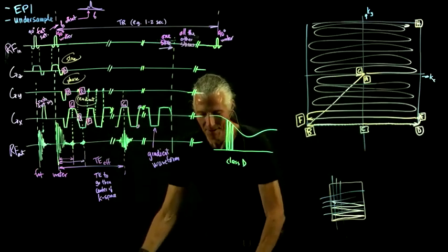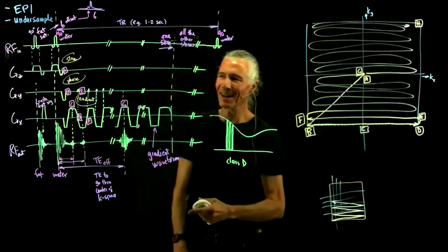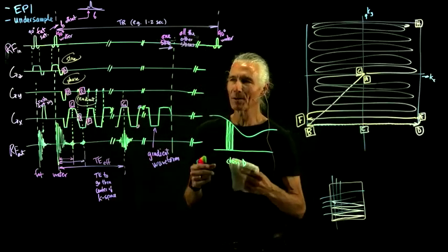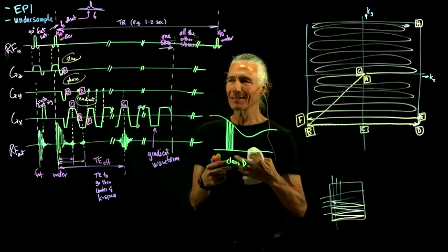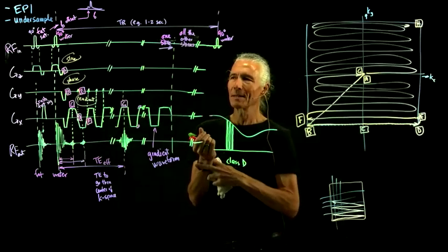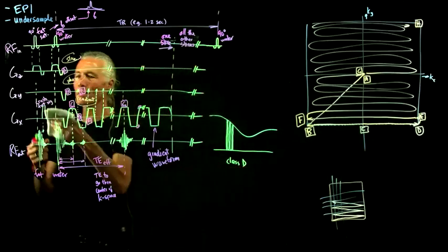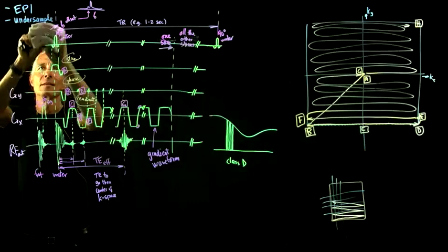Okay. So we haven't talked about speeding this up even further, and so that's for Friday. Almost all the time people are doing something called multiband now, where you record multiple slices at once. And so we'll talk about that. That's like the ultimate speed up. So we'll talk about how that works. But in order to understand how that works, we have to understand about undersampling.